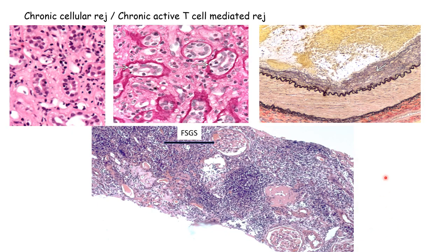Moving on to the chronic changes, when the biopsy has significant lymphocytic infiltrate in some regions and in other areas shows you interstitial fibrosis with small tubules of tubular atrophy, then this is labeled as an active component with a chronic component, suggesting a diagnosis of chronic active T-cell mediated rejection. So just to summarize that, along with the changes of chronicity, the identical changes that you see in active T-cell mediated rejection may be seen pari passu in different regions of the biopsy.